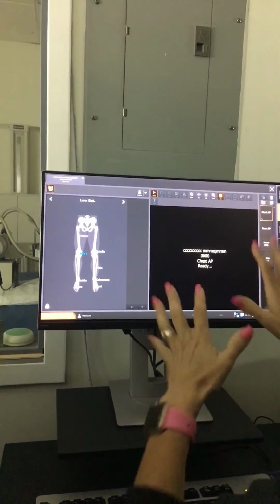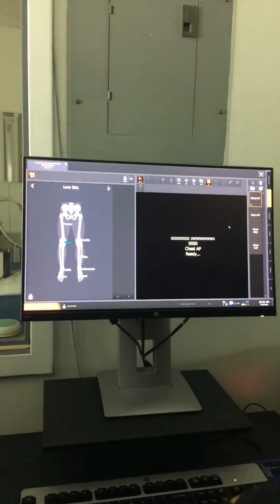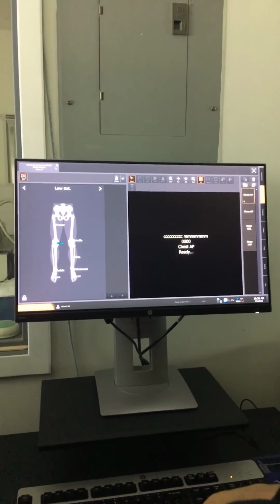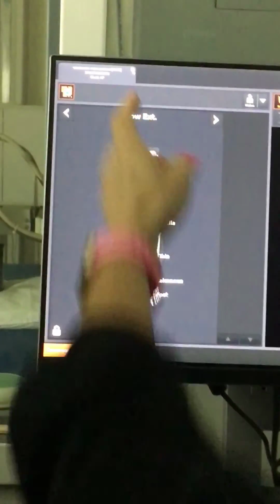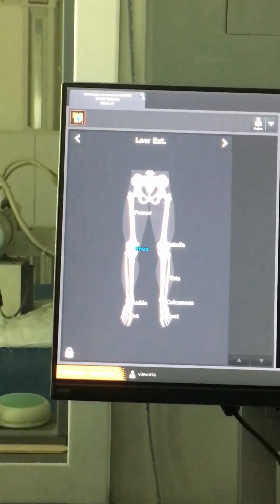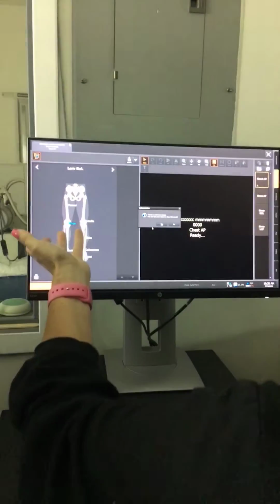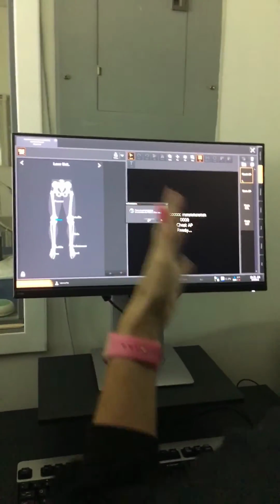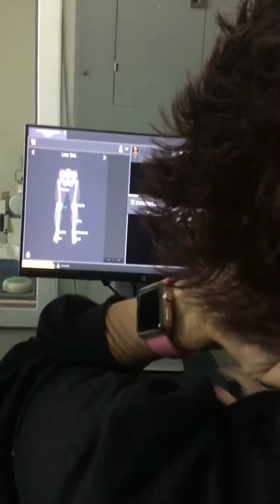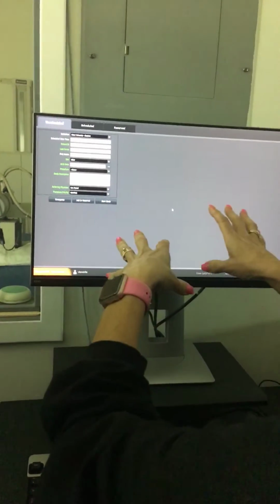Okay? Once you shoot and you've got your image, at that point, all you're going to do is exit, which I believe you want to click up here, not that one. It'll say your name. And when you click it, it's basically saying you didn't shoot anything. Are you sure you want to close it? I don't remember what it says, but I'll come over here when you guys are shooting just to make sure it works. But I'm going to close it. When you guys close it, it'll save it.